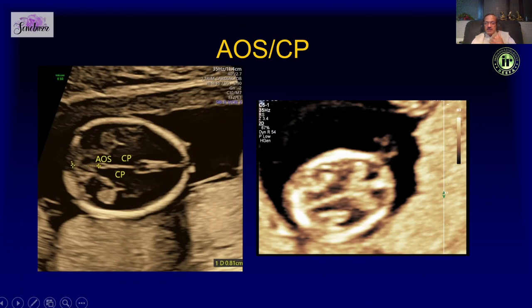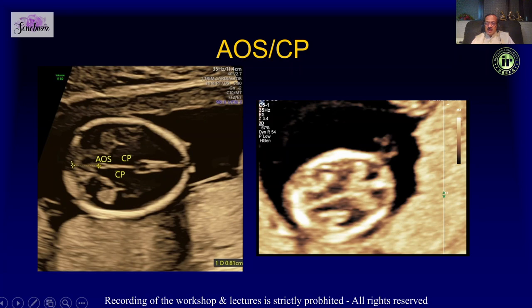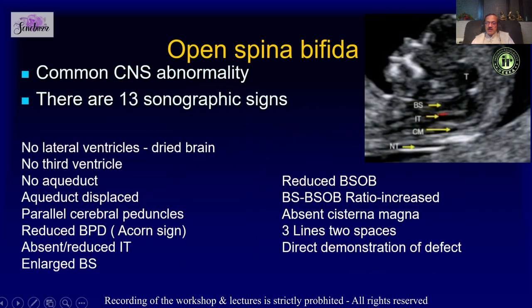When you go one step down from the BPD plane, you can see the cerebral peduncles and the aqueduct of Sylvius. We can measure the distance between the aqueduct of Sylvius and the occipital bone. In spina bifida, you see parallel cerebral peduncles and the aqueduct of Sylvius is pushed toward or moves toward the occiput, or it can become obliterated.